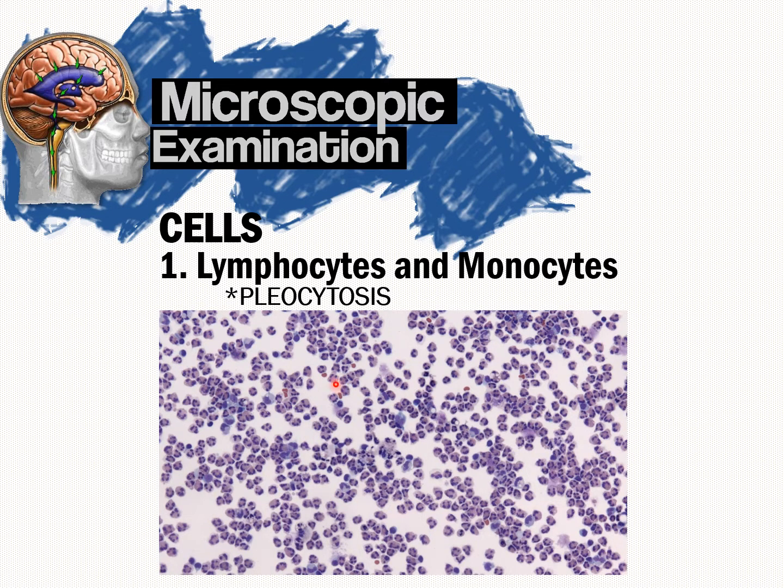There is a need to perform differential count when there are increased numbers or when there is pleocytosis. Increased WBC count with increased neutrophils indicate bacterial meningitis. Moderately elevated WBC count with increased lymphocyte and monocyte suggests viral, tuberculous, fungal, or parasitic origin. Moderately elevated WBC count with increased normal and reactive lymphocyte and plasma cells indicate MS or multiple sclerosis or other degenerative neurologic disorder. Reactive lymphocytes containing increased dark blue cytoplasm and clumped chromatin indicates viral infection. And increased lymphocytes may be seen in cases of HIV.